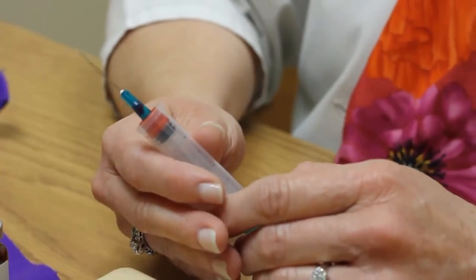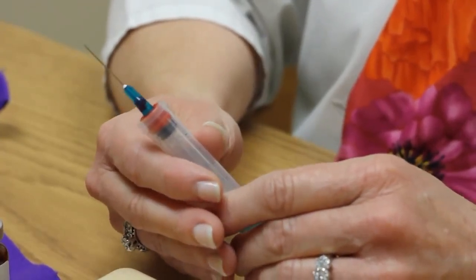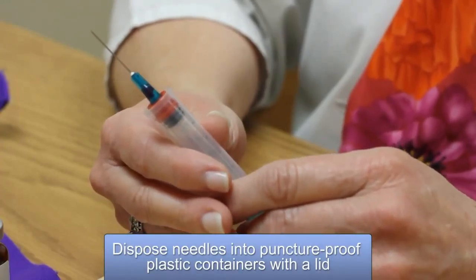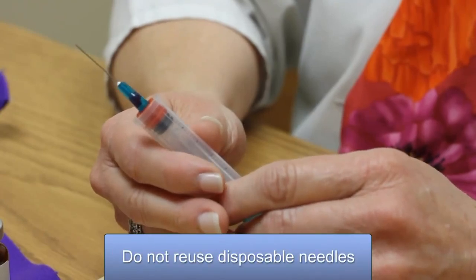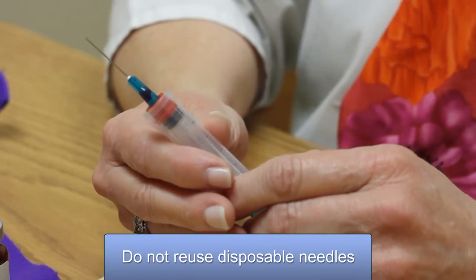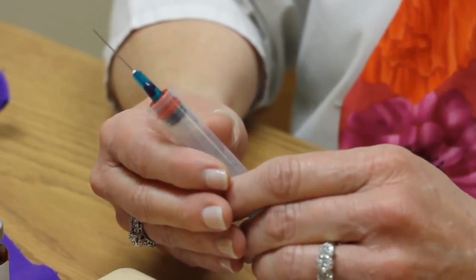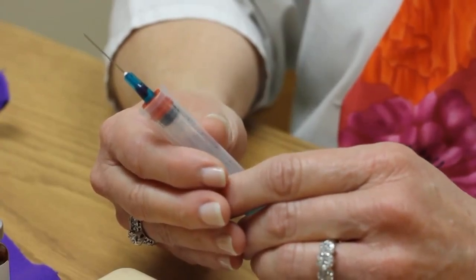After you complete the injection, you need to make sure you properly dispose of the needle. You can use many household items such as a milk carton with a lid, a liquid detergent bottle with a lid, or a coffee can with a lid — as long as they have lids and are secure so people can't reach in or puncture through the container. My name is Cindy Anderson and I'm a nurse at Amarillo Diagnostic Clinic.